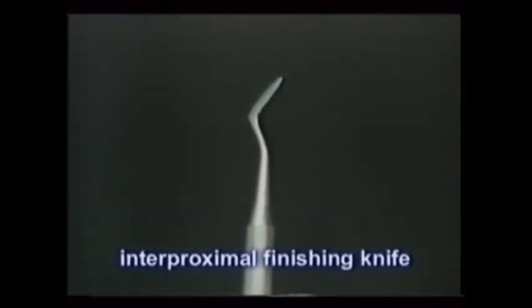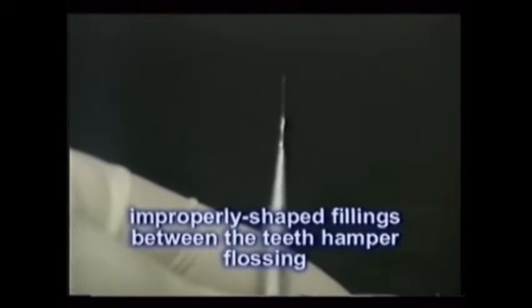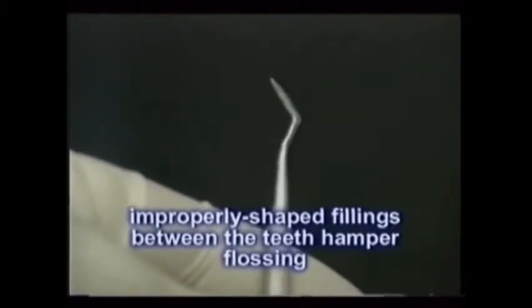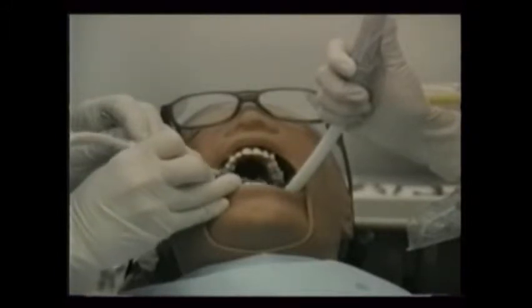The interproximal finishing knife is a thin-bladed instrument that shaves over contoured fillings between the teeth down to a more normal anatomy. Some dentists use an explorer for this step. Improperly shaped fillings between the teeth hamper flossing severely. Only a high-speed burr on a high-speed handpiece can remove the excess of a filling that is fully hardened.